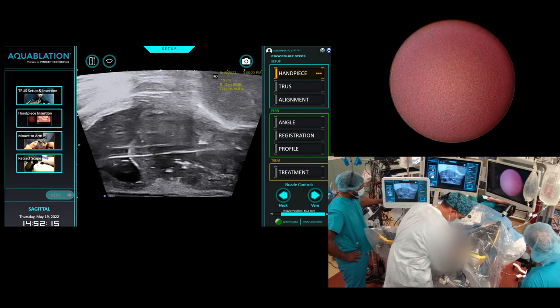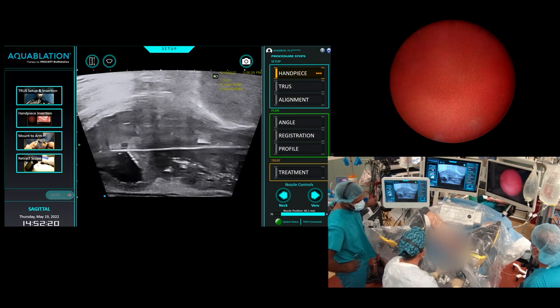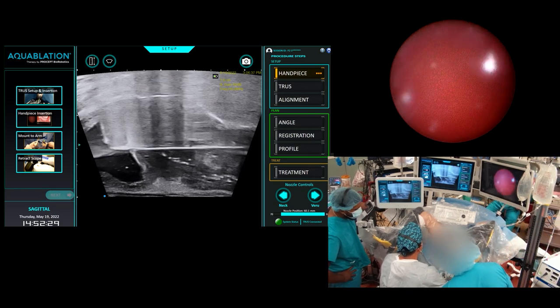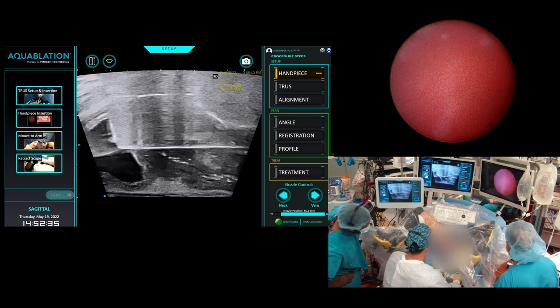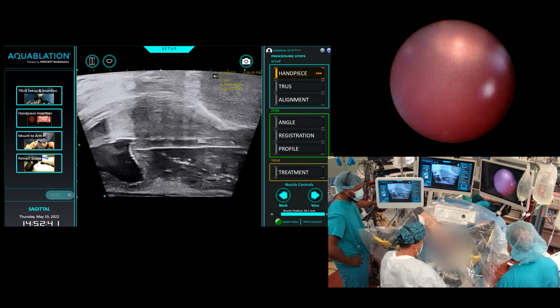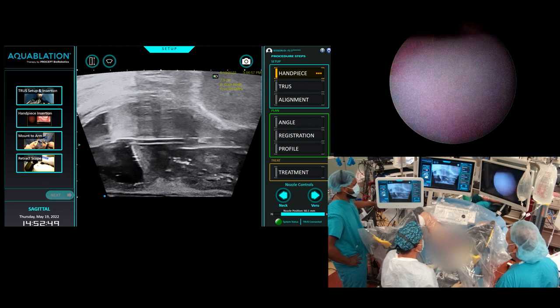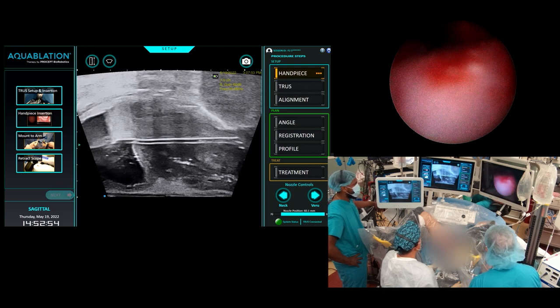Nice bladder. Water off. Still got the scope in. Look at that — it just kind of compresses. Come up a little bit, shift everything to the left a little bit more. I'm as high as I can get, right at that anterior commissure. That's a massive prostate — massive. Look at that big central tissue there.